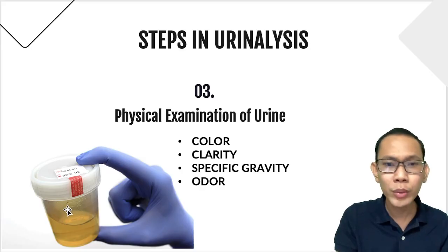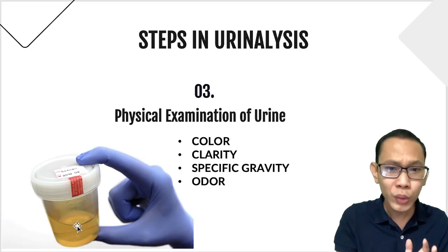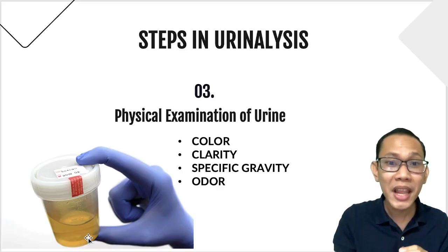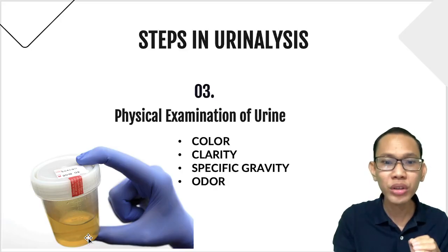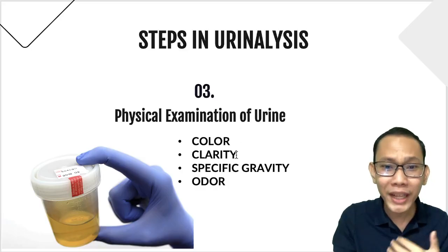What is the clarity? When we talk about the clarity, you are talking about the transparency or turbidity of your sample. So what can you see? Describe the clarity of this sample. Of course, this is clear. So based on this parameter, we can say that your physical examination is basically based on your observation or somehow your senses. That's why it becomes very subjective now. Yeah, it's very subjective because it's how you interpret the color and the clarity.